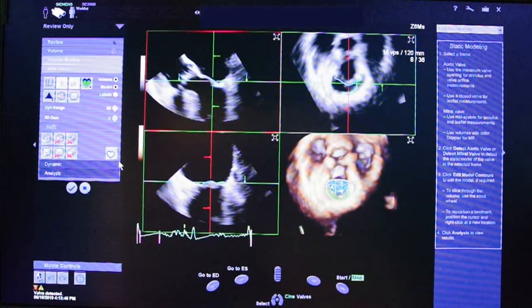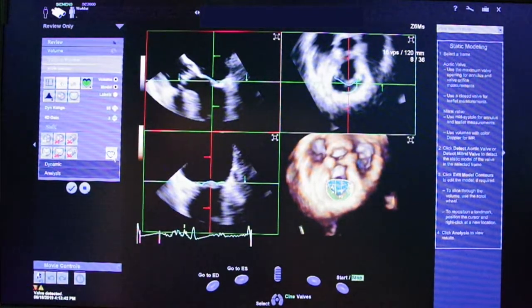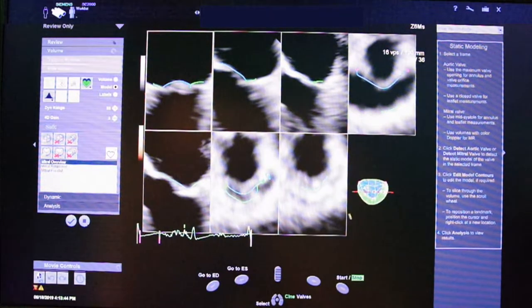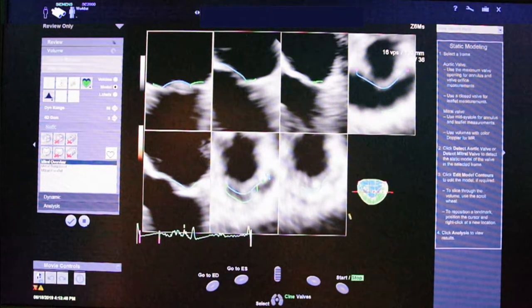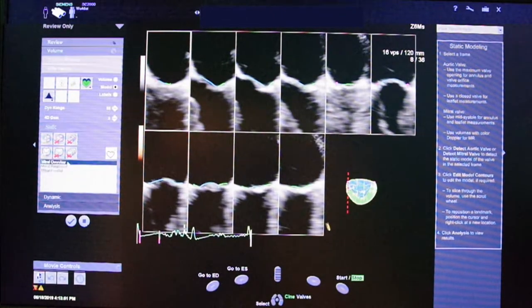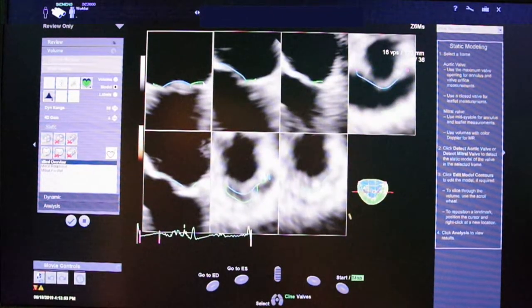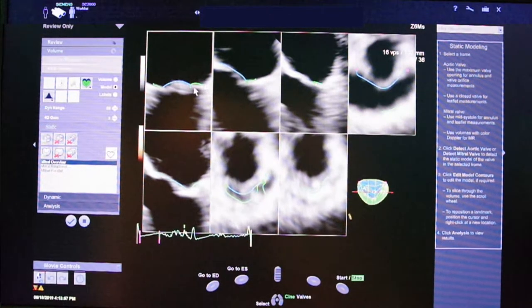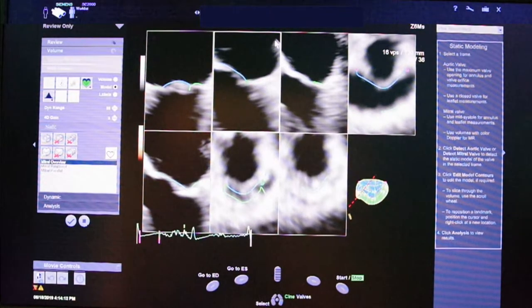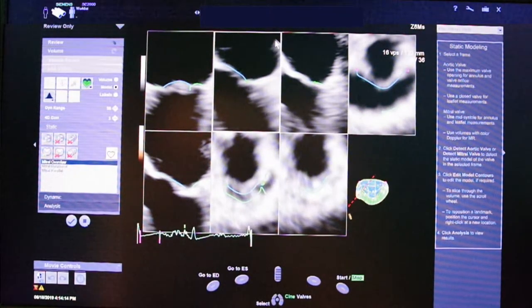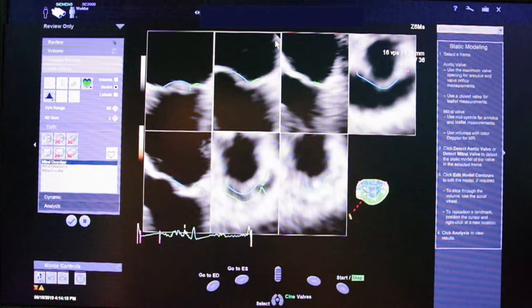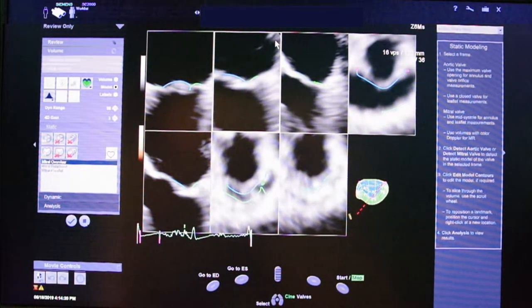It is possible to manually adjust such model by clicking on this button. Three different visualization interfaces named Overview, Rotational, and Parallel are available for MV editing. Annulus points and leaflets can be modified by clicking and dragging them into the right position. By using the scrolling wheel while the cursor is on a panel, it is possible to go through all the slices of the 3D volume on different planes.